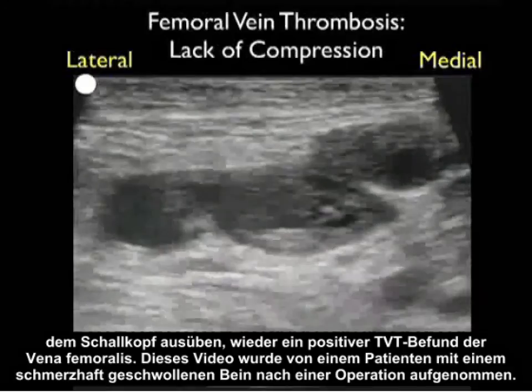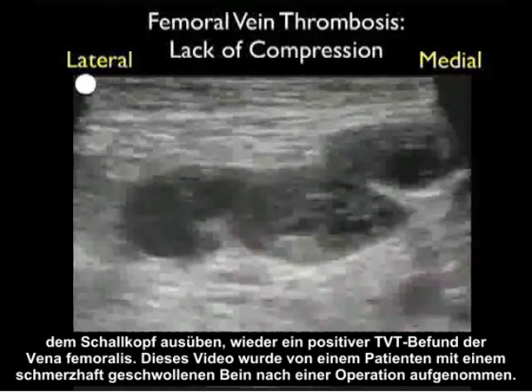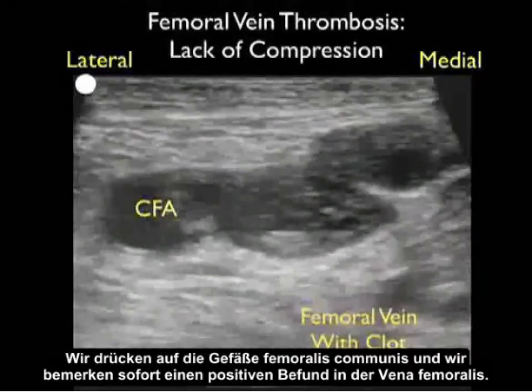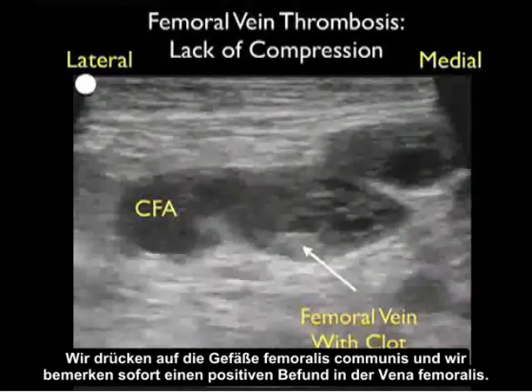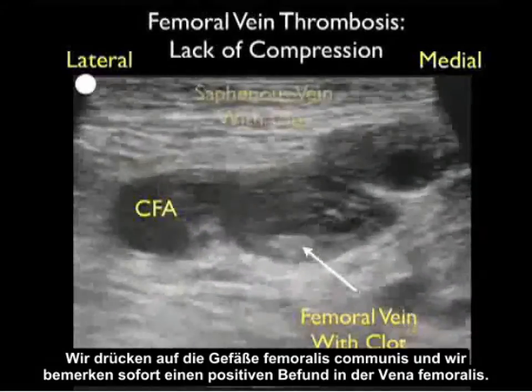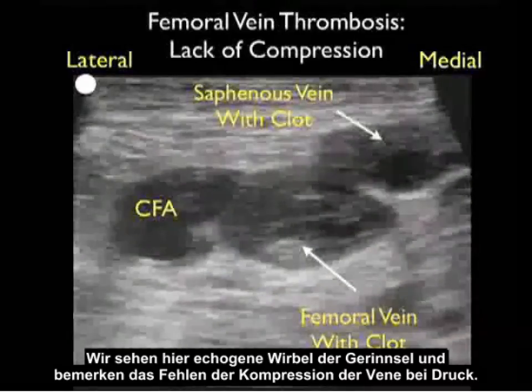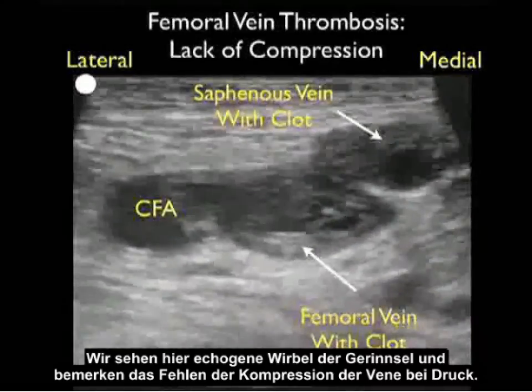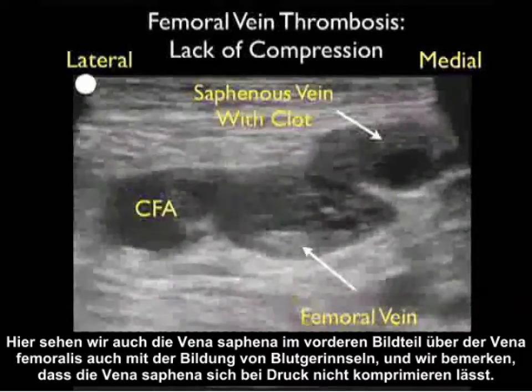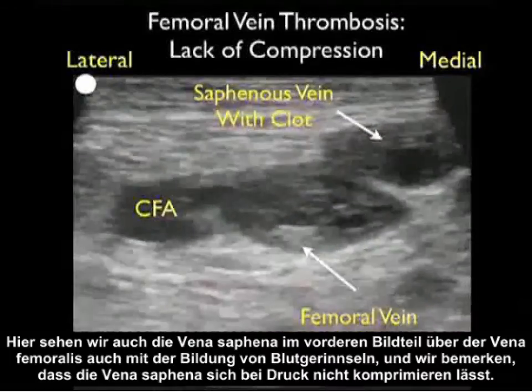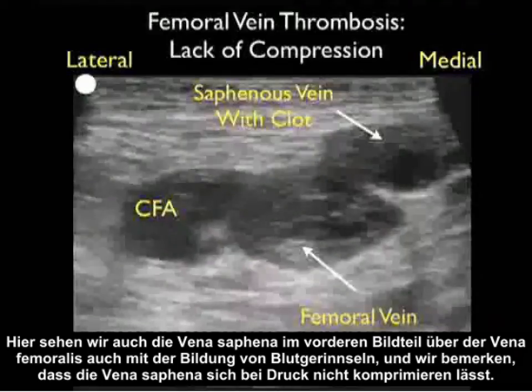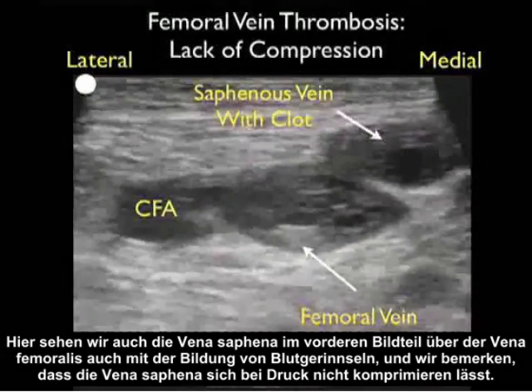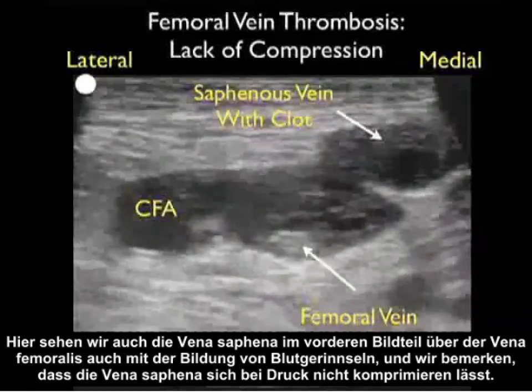This video clip was taken from a post-surgical patient with a painful swollen leg. We're applying compression down to the common femoral vessels and notice right away a positive finding within the femoral vein. We see echogenic swirls of clot and notice the failure of compression of the vein with probe pressure. We also see the saphenous vein towards the anterior part of the image above the femoral vein, also with clot formation, and the saphenous vein also fails to compress with probe pressure.